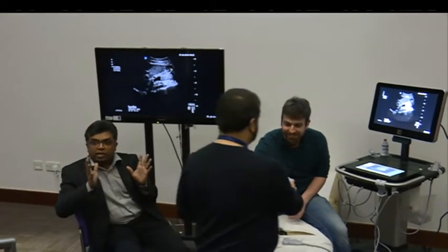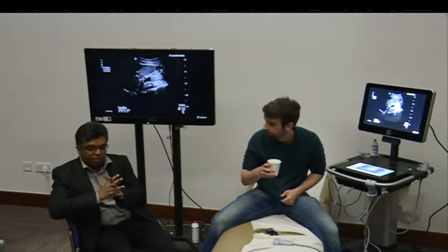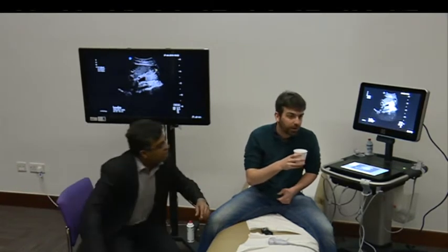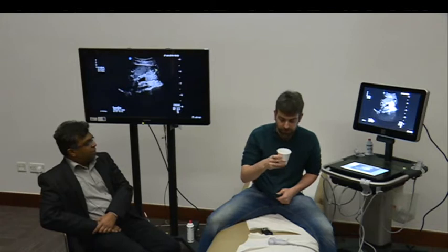That's roughly more than 100 ml. The way I remember it: if it is more than 10 cm² it is definitely more than 100 ml of content in the stomach. So we'll give him about 100 to 200 ml and see what happens.